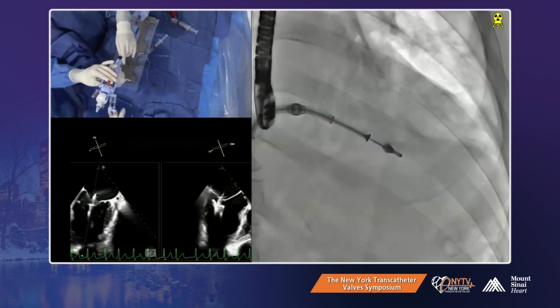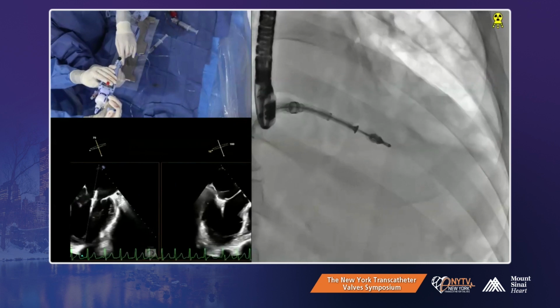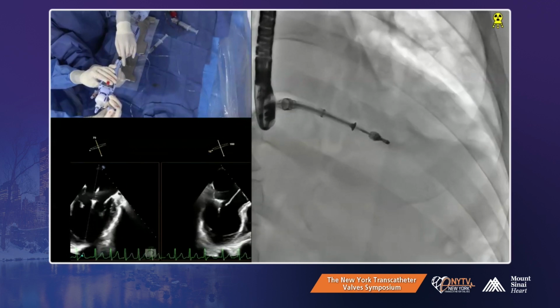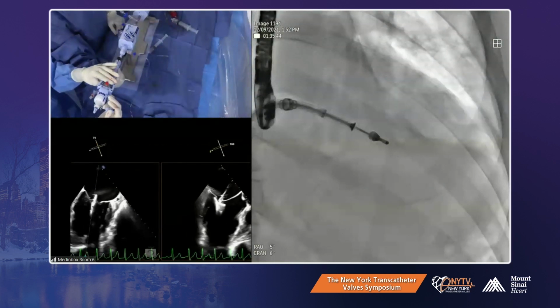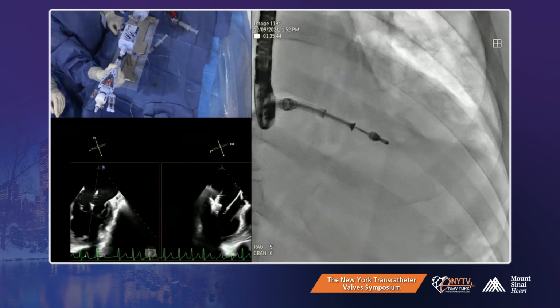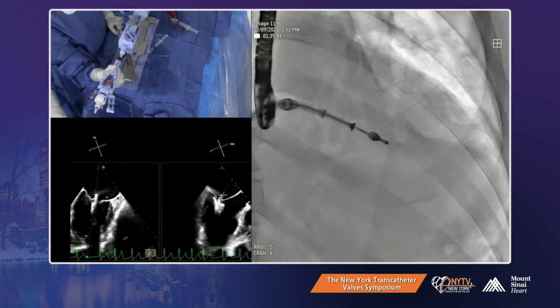Come straight up. I'm surprised we cannot decrease the pulse rate further. With everything else, we cannot bring it down, huh? This looks much better. Get the clip arms more equal length. Everything looks good. It just needs to hit the device. Now, what else can we do? Because we need to bring it to 80. The problem is the heart rate. Otherwise, in normal circumstances, you would be able to.